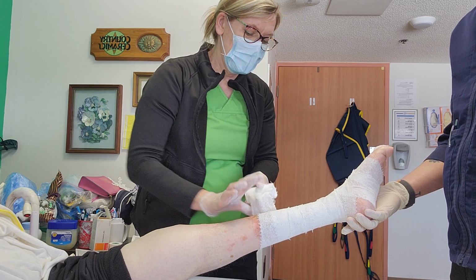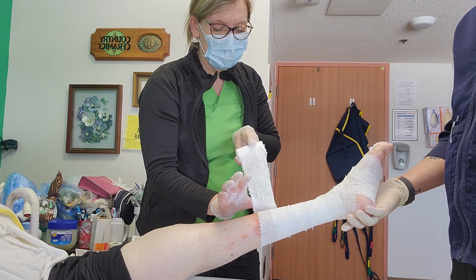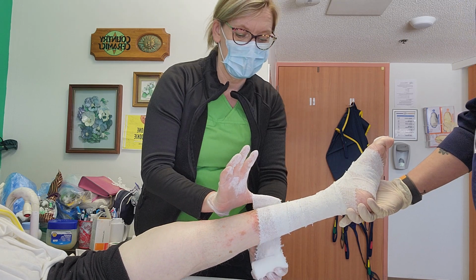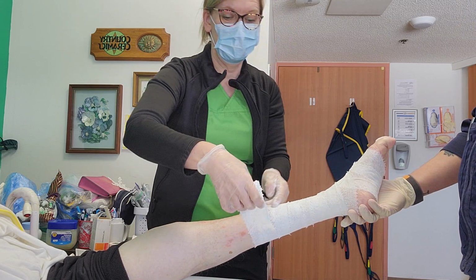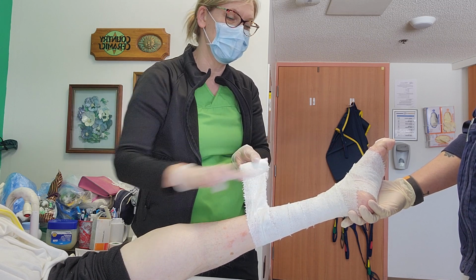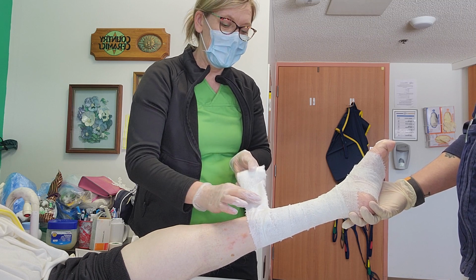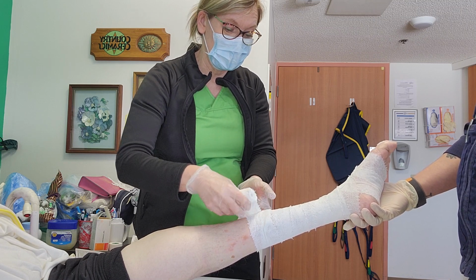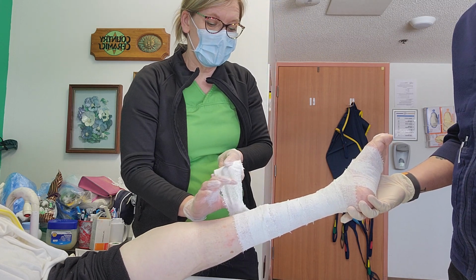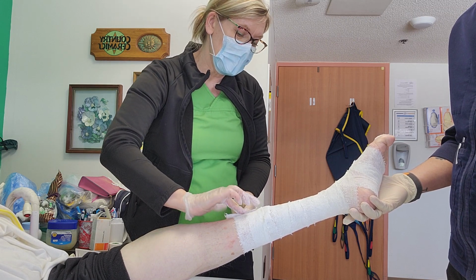The modified Una boot will have the Viscopaste in this C pattern. So again, I'm going to go over it again as I've done some, but I'm going to pleat it. So what I end up doing is I push my thumb, pull it back around, and then I do it again. So I'm not wrapping around. What happens is then you allow for, if there's a fluid bolus that comes into the leg, that it doesn't become too tight. Because that's the part that irritates most when it's maybe summertime and they've had a little bit of fluid go into their leg, or again, just when the compression is uneven, when they're wrapping spirally around. This helps to stop that.